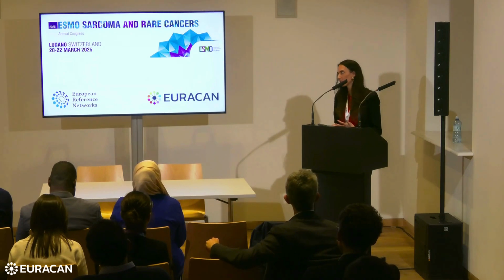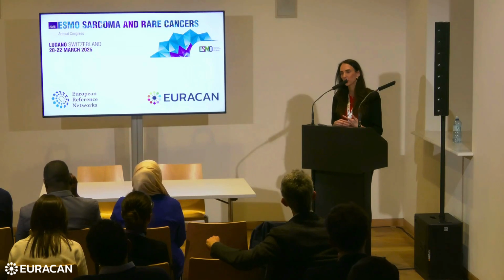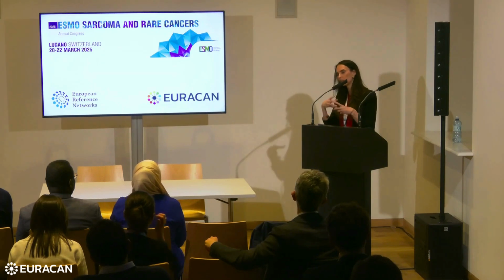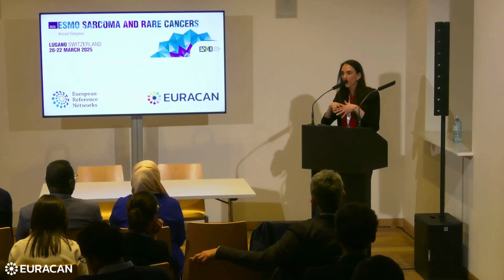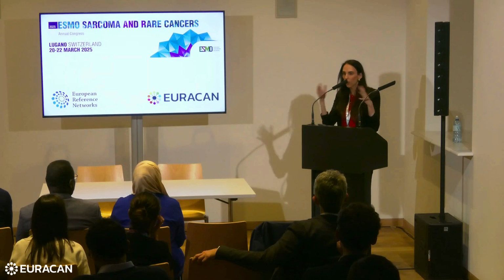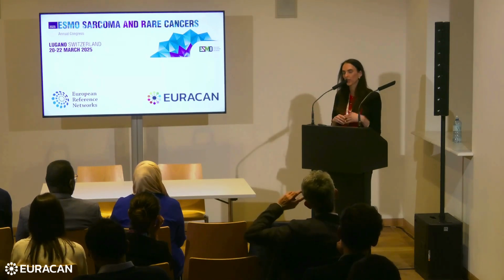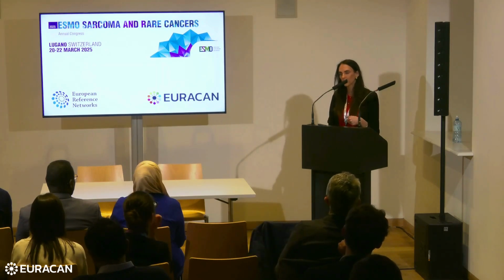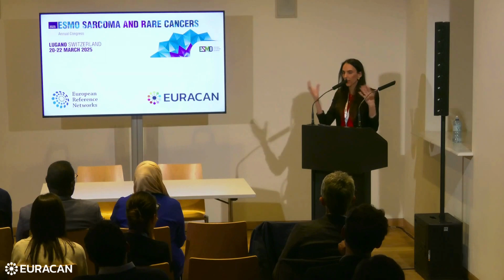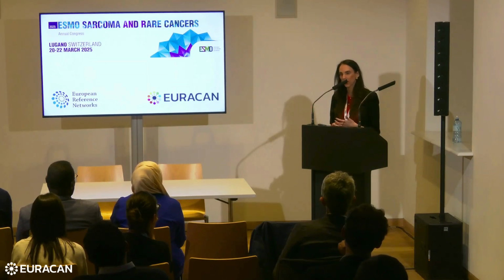And one of my favorite sequences is diffusion-weighted imaging, because then you can also see a transformation to more malignant parts of the tumor without a big change of growth. So when I read images, I take all the sequences I have, and usually also in the outpatient clinics, we have T1, T2 FLAIR and also the diffusion-weighted image. I think we have to look at everything in summary, but volumetric measurements will be the future, I'm pretty sure.